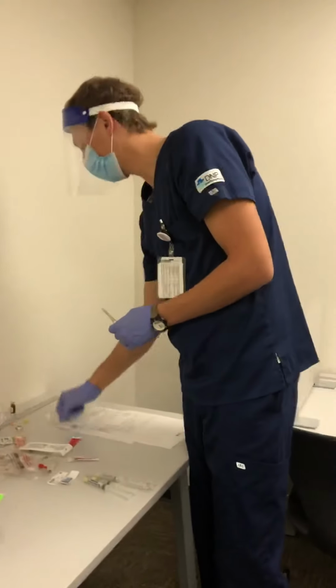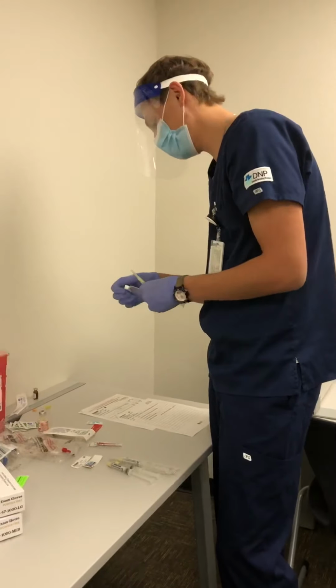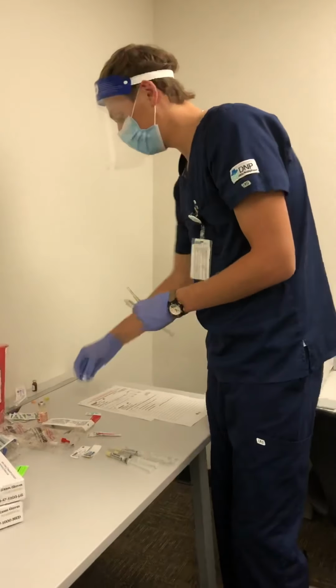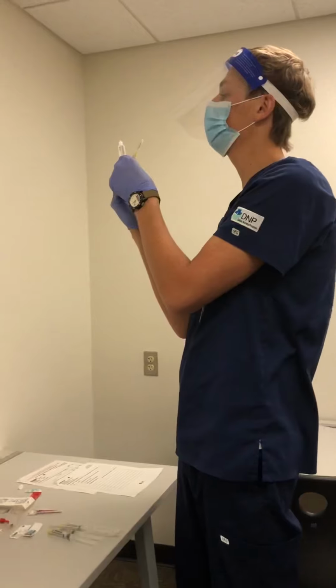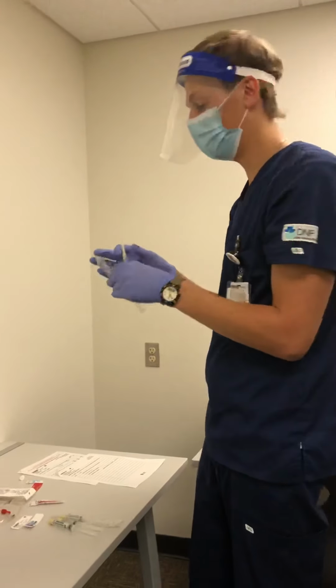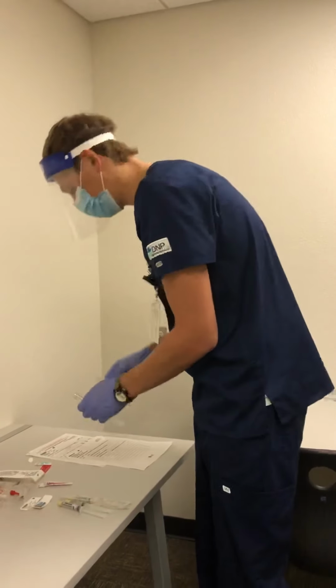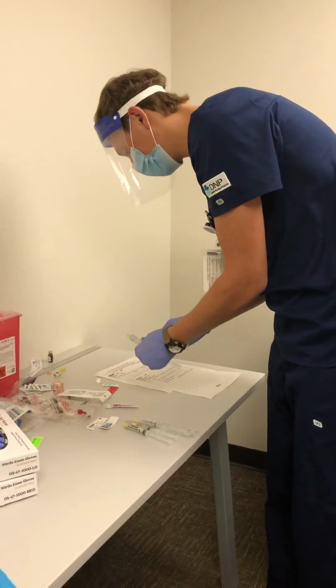Okay. And then I also need to dilute this with 1 mL of regular saline. So I just have a saline flush here. I'm going to uncap that, make sure that it's aspirating so I won't get any air in there. Okay. Just going to take my needle off from the cap.